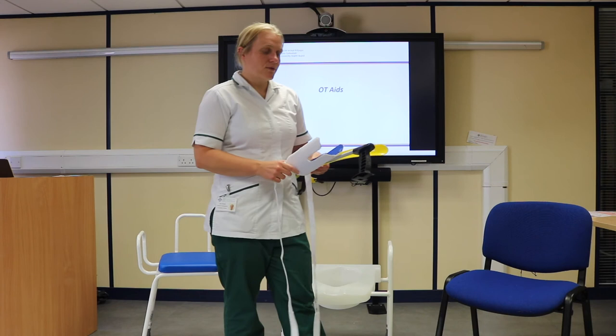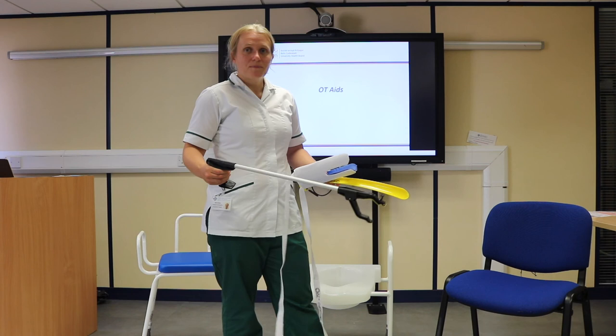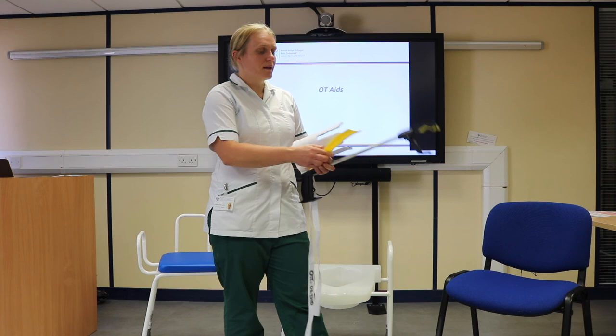To enable you to follow the hip precautions so that you're able to get yourself dressed at home, we'll also provide you with some dressing aids: a sock aid, a long-handled grabber which is an extension of your arms to allow you to bend down, and a long-handled shoe horn to help you put your shoes on.